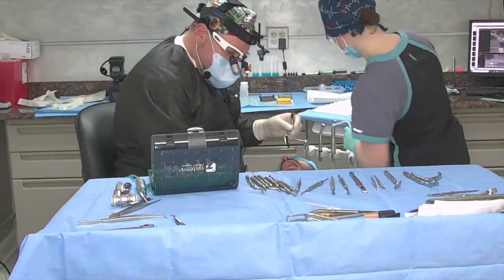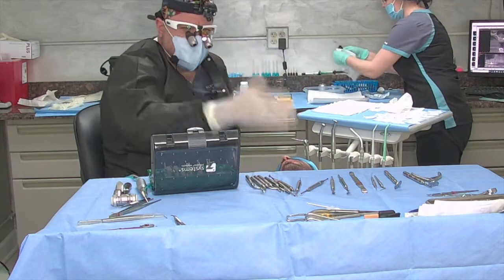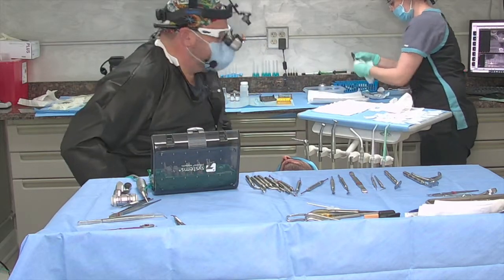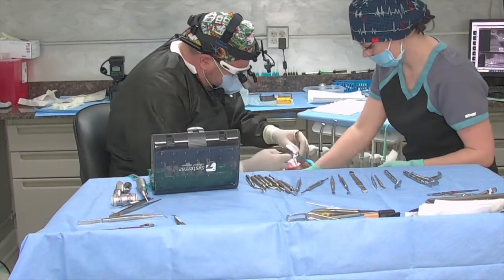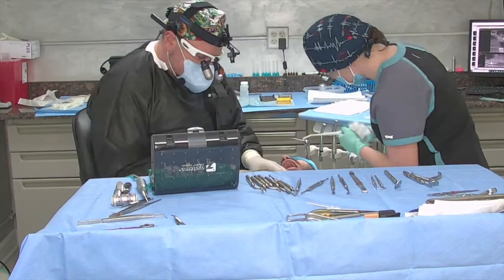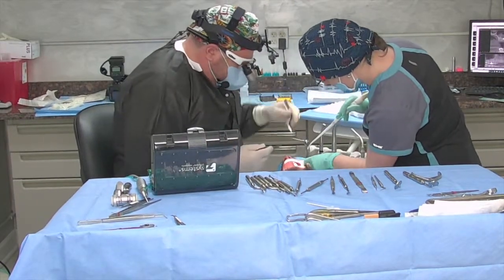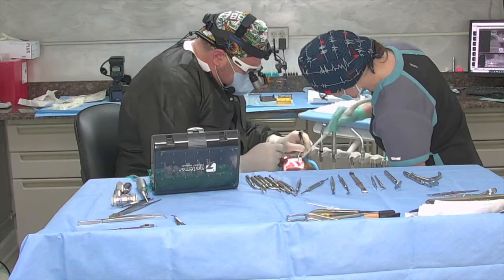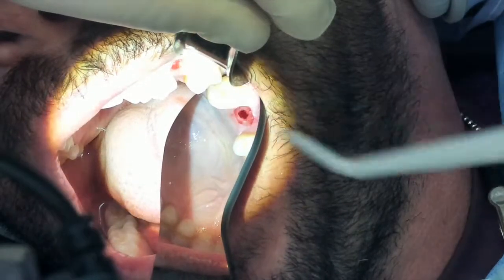Now I'm going to put this in upside down so I remember. Okay, if we can get here one more time, please. Sorry for the stop and the starting. I just want to show you each step of the way with the mirror and kind of where we're at. Okay, Matt, let's open again, and if you can, the suction right now. Sorry about that. Okay, great. All right, so go ahead and suction this. If you're looking, you can still see the floor of the sinus in the mirror. So right now we're at 7 millimeters and we're stopping short.